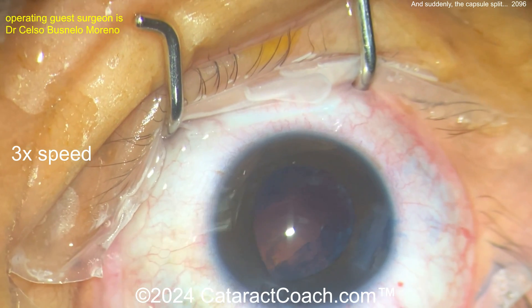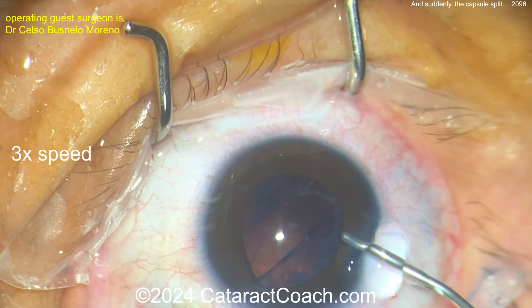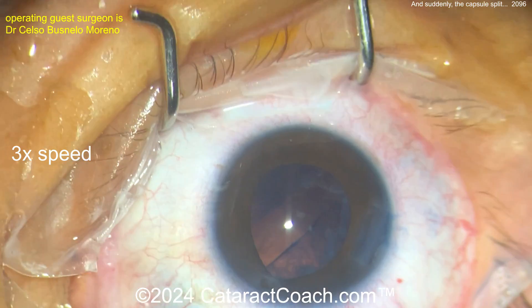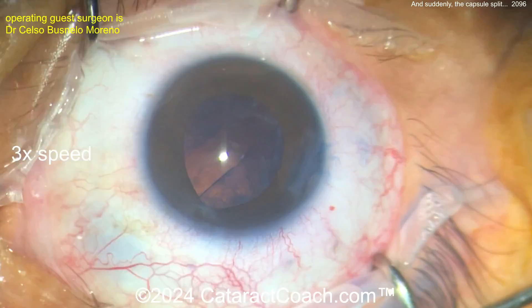Be careful coming out of the eye — I'd like to reinflate with some viscoelastic before doing that. There's the viscoelastic, that looks pretty good. More viscoelastic. Not sure how much cortex there is, and what do we do for the lens? Let's just watch and see.